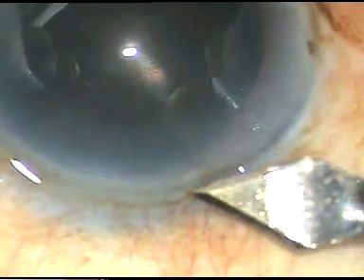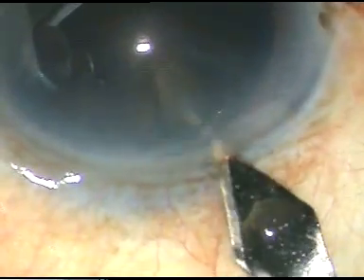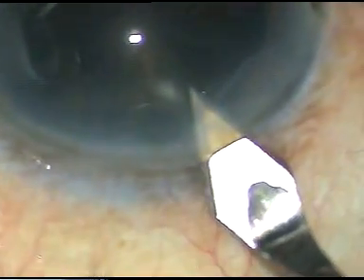Friends, this is a very hard cataract. You can see the cataract appears almost black. Let us watch the surgical steps.